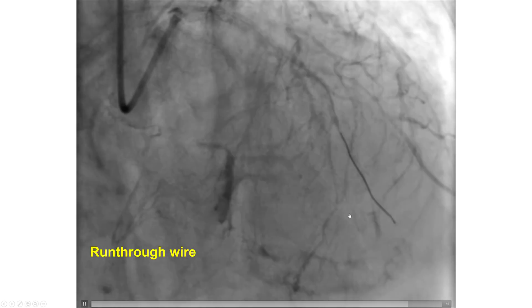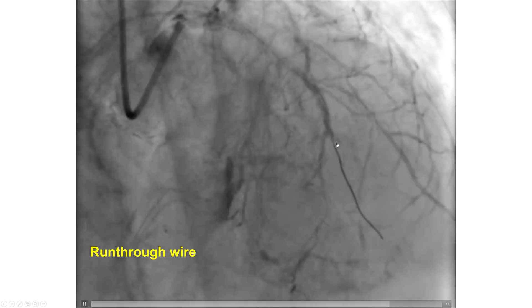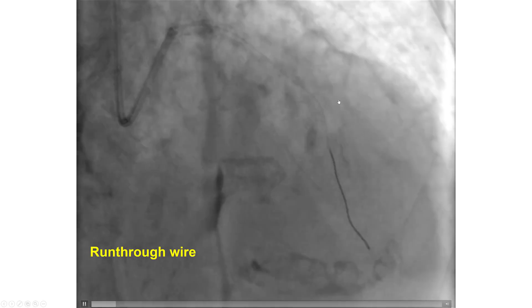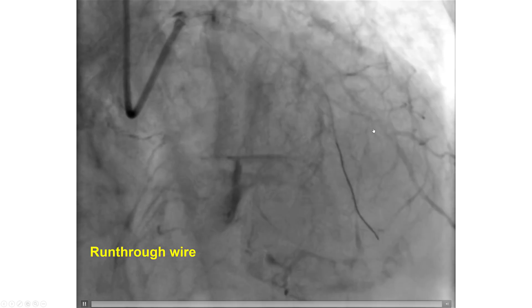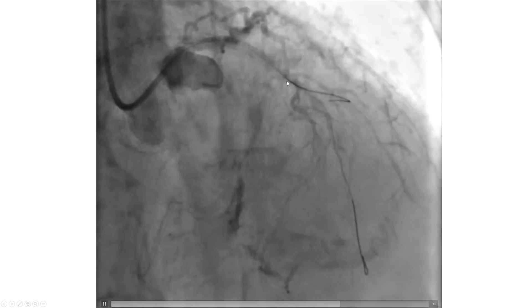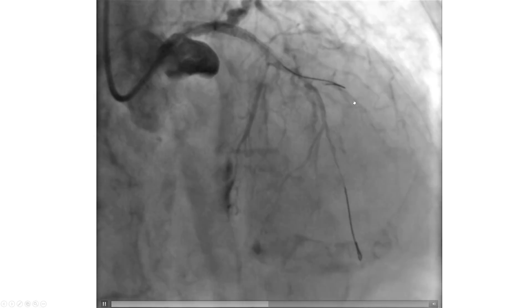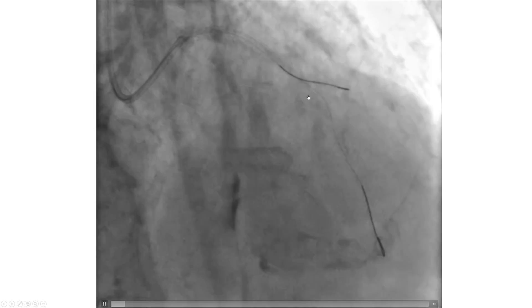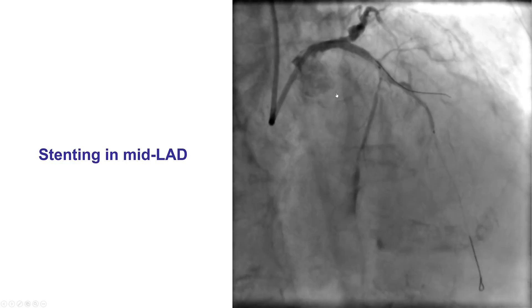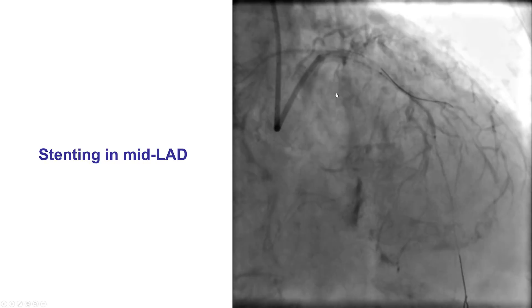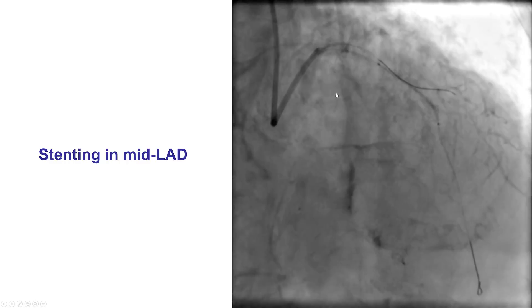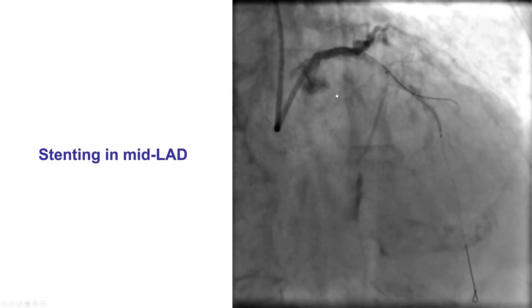Finally, we were able to get a workhorse wire all the way into the mid to distal LAD and achieved some flow into the LAD and TIMI flow into the large diagonal vessel as well. We attempted to advance a guidewire into the diagonal given the large size, but wiring was quite challenging. After multiple attempts we gave up and decided to place a stent into the mid LAD to cover the area of ulceration.